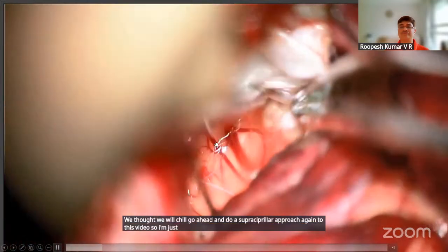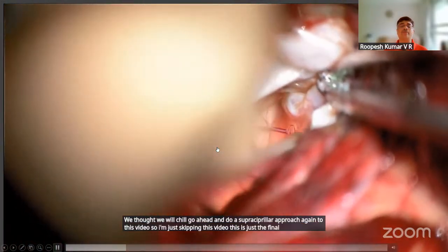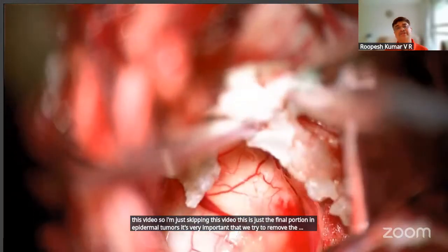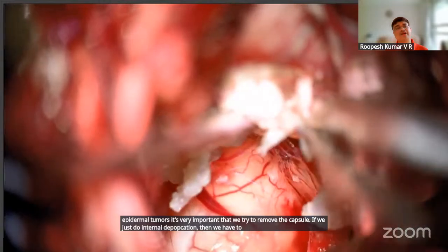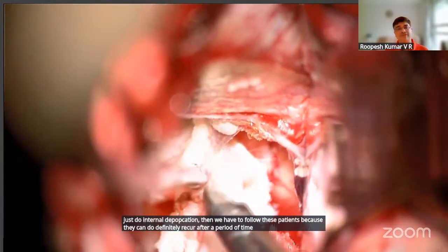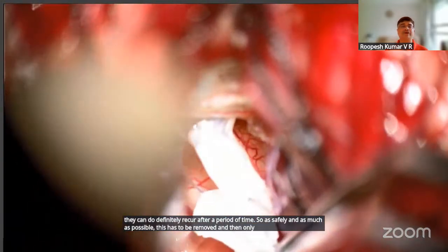Again, I'm just skipping this video. This is just the final portion. In epidermoid tumors, it's very important that we try to remove the capsule. If we just do internal decompression, then we have to follow these patients because they can definitely recur after a period of time. So as safely and as much as possible, this arachnoid has to be removed, and only then can we prevent recurrence. Otherwise, they are completely curable diseases.